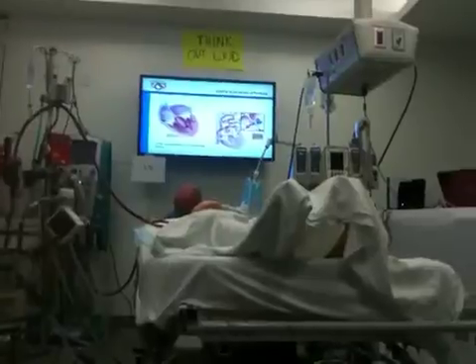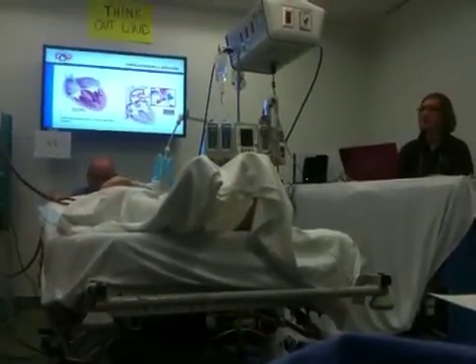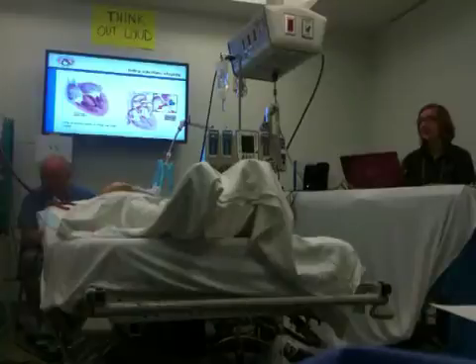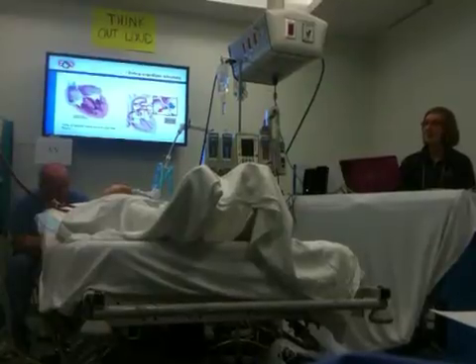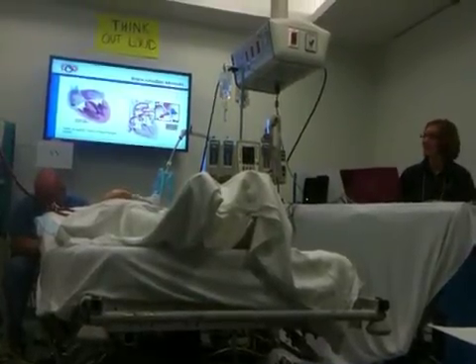They just wanted to have us go through again, for your adult patients, having air going back into that arterial return. The ones that you're most worried about would be that intracardiac shunt. A few microbubbles going into the right atrium, the lungs will likely filter out those microbubbles. And actually, I've heard Dr. Bartlett say up to 60 cc's. He's not worried. Seems like a lot of air to me, but I trust Dr. Bartlett. So I've often quoted that that's what he's passed on.